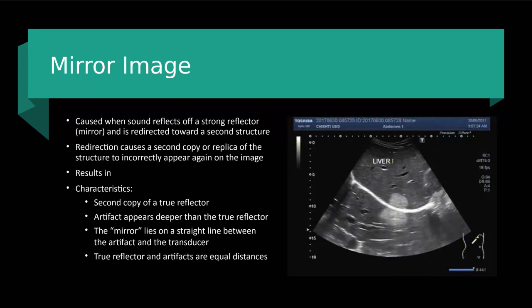You're trying to determine, are these two different things, or is this the same thing, one on top of the other? Am I getting mirror artifact? So look at your surroundings, see if any other tissue is being projected as a mirror artifact as well, and then that can help you determine, is this really two findings, or am I just looking at one pathology with a mirror copy?